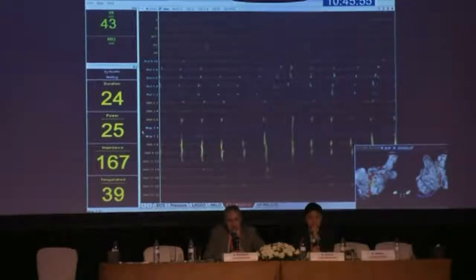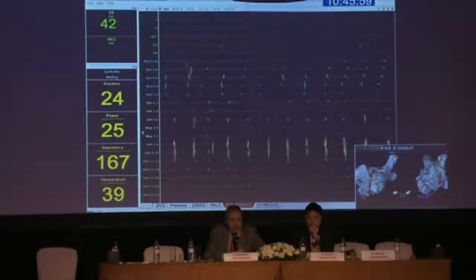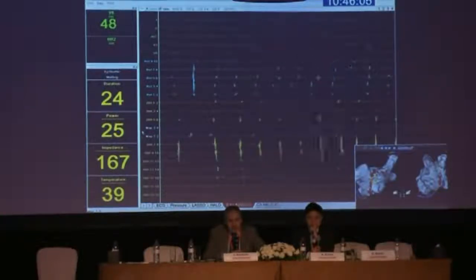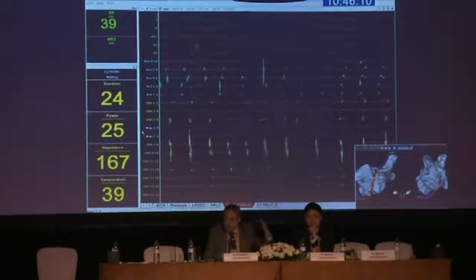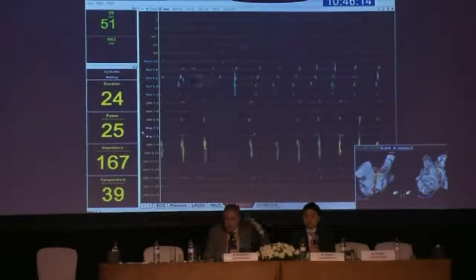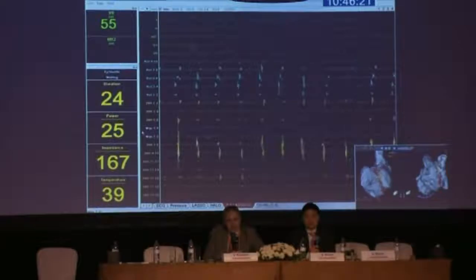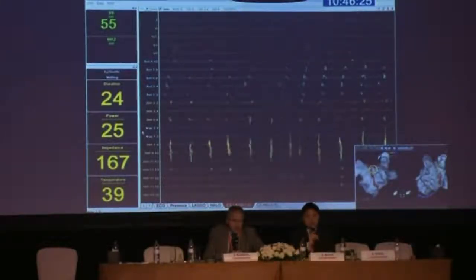But of course, this is again some arbitrary figure that was obtained from a limited number of patients. But it's clear that the more the catheter is stable, the higher contact force, the better lesion. And if it's jumping or if it's moving with the respiratory movements, then it takes a bit longer to get the similar value. Yeah. Can we take the question from the audience, please?